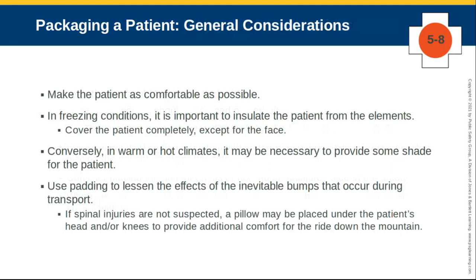General considerations: make the patient as comfortable as possible. In cold temperatures, your toboggan should probably include a blanket, and we want to provide that to the patient, not just for padding, but for insulation as well.